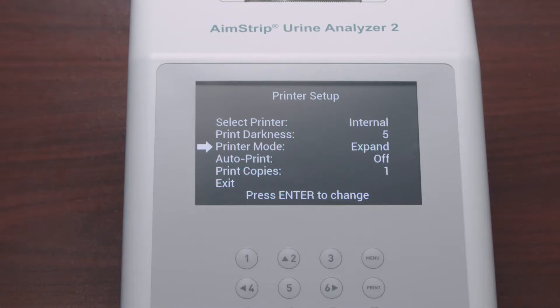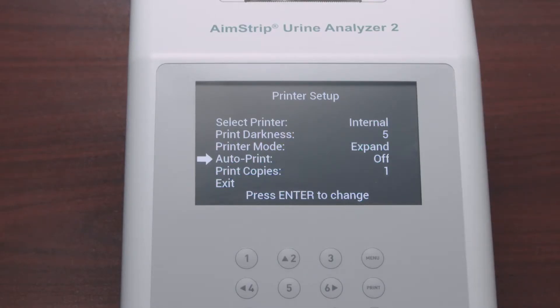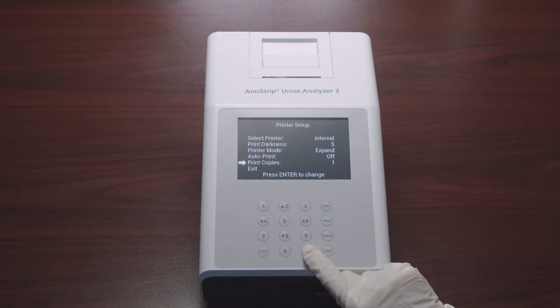For Printer Mode, selecting Normal prints the standard font size while selecting Expand prints a larger font size. Next is Auto Print: selecting On prints results after each test and the printer icon is displayed; selecting Off requires pressing the Print key to print results, and the printer icon is not displayed. Last is Print Copies, which defines the number of result copies printed at one time — it can be set from 1 to 3.